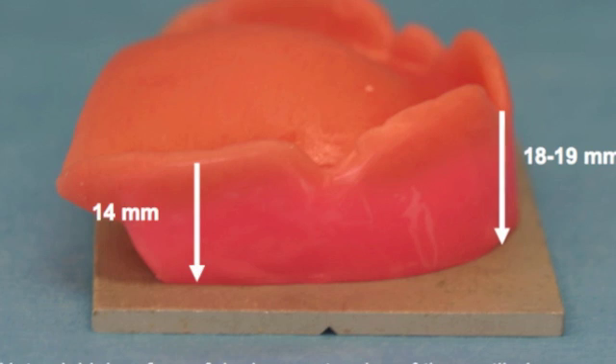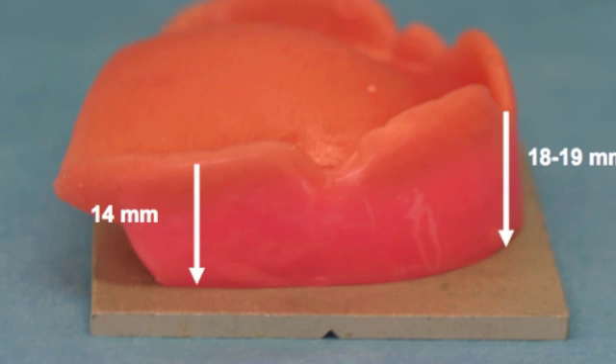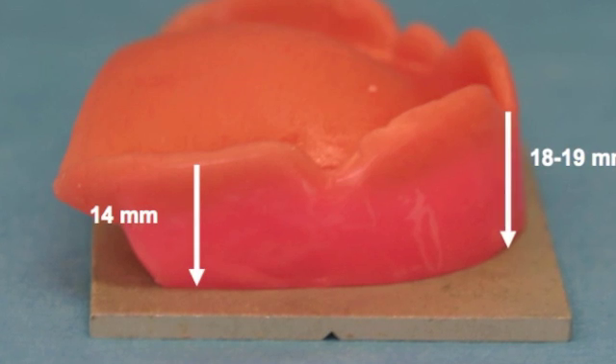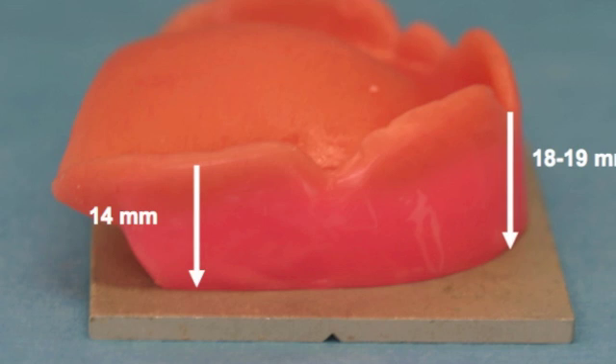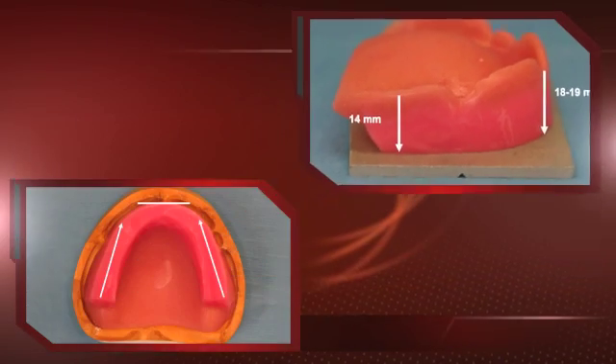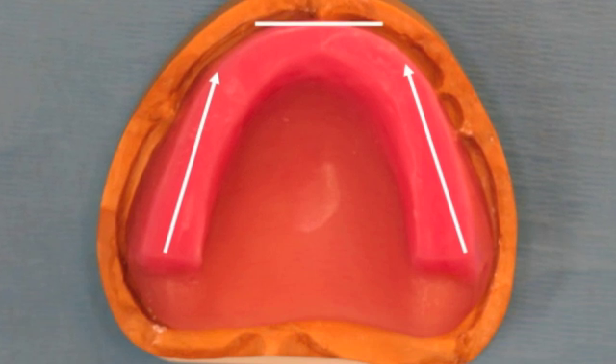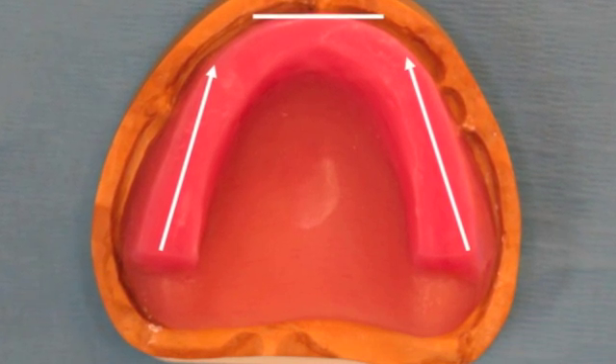On the maxillary cast, fabricate wax rims. The thickness should be 18-19mm from the labial frenum and 12-14mm from the flange rim at the first molar area. The second view of the maxillary wax rim shows the rim facial to the crest of the ridge.